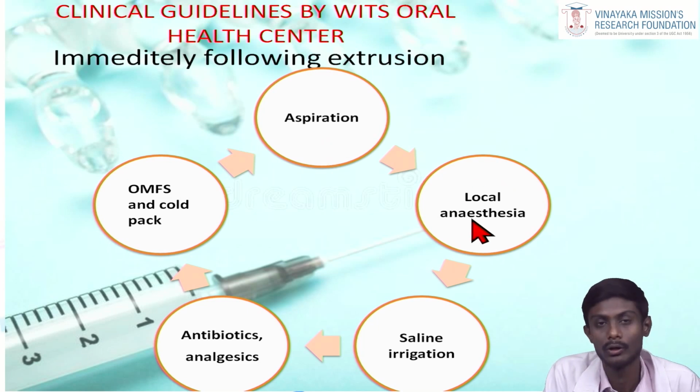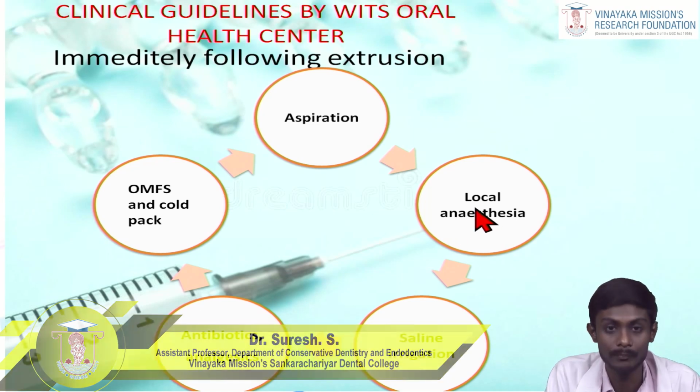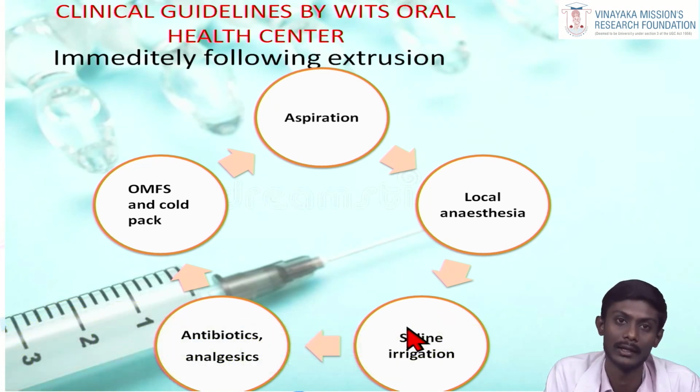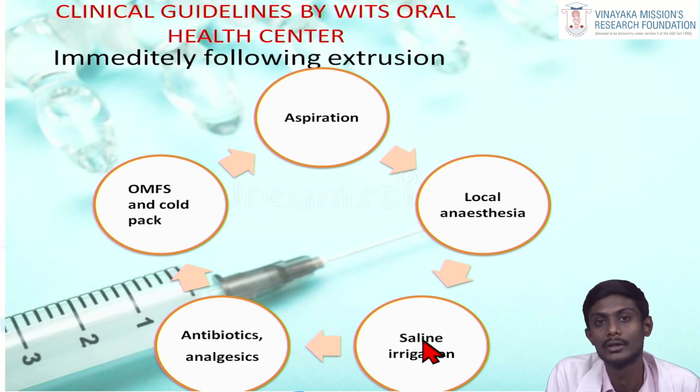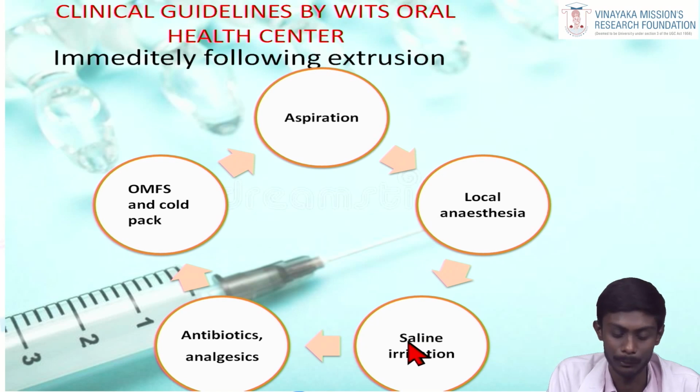Next is giving local anesthesia at the specific region in order to relieve the patient's pain, followed by copious saline irrigation into the root canal space, even into the periapical region, which can neutralize the pH of the sodium hypochlorite and also decrease the symptoms exhibited due to the sodium hypochlorite. Then it is followed by antibiotics and analgesics.